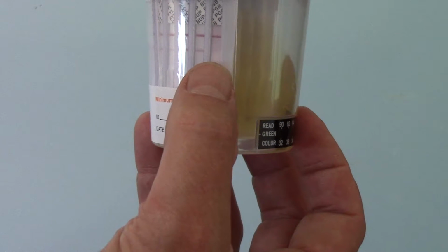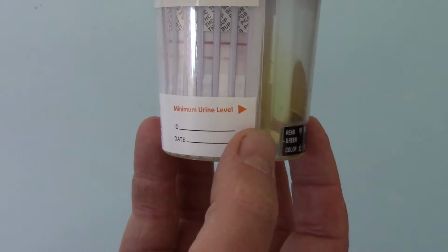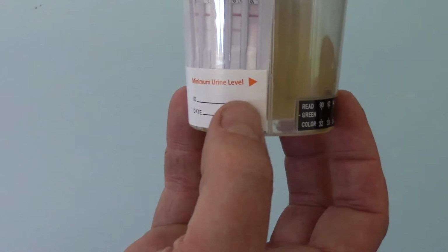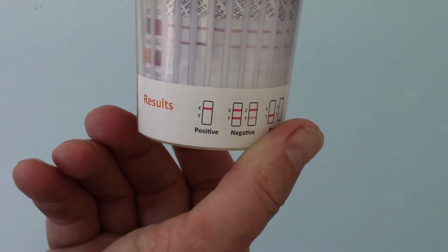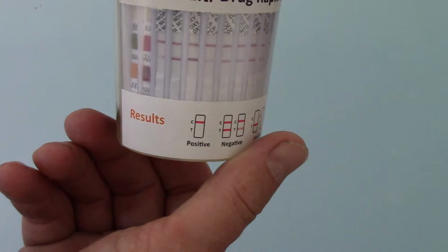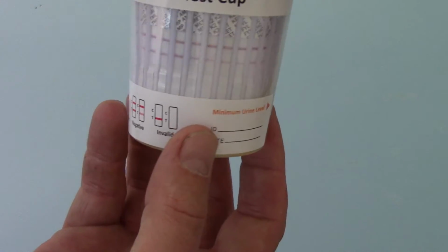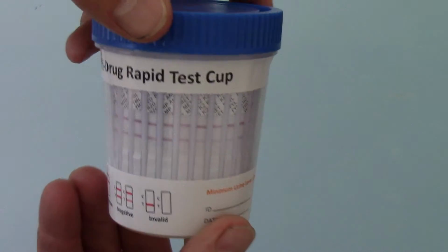But if they haven't formed, and if we show you around here on the pregabalin one, we've got a line just very, very slowly forming, but that's the most resistant to showing a negative result here, and the line is very, very thin and very faint at the moment. So in that situation, if there's any doubt, we would say to the examiner to wait for the full test time to develop, and then read the result that is showing at the correct read time.